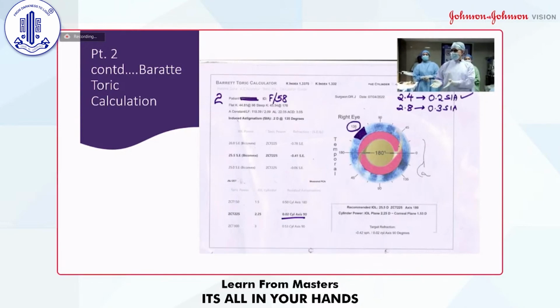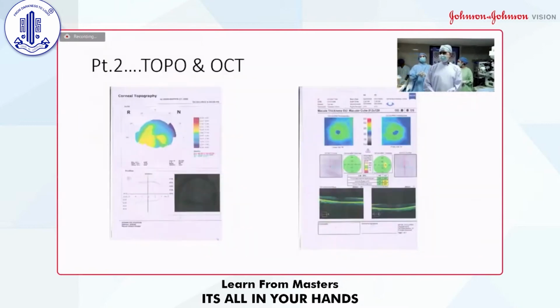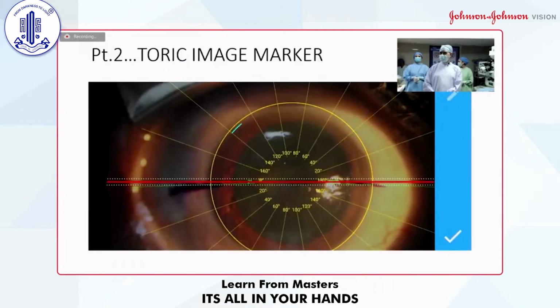See, as I told you earlier, we have to play with the placement of the incision, the size of the incision, and at the end, the cylinder should be less than 0.25 or so. So here the desired is only very less, 0.02. So this manipulation you can do. Next. So this is all normal.